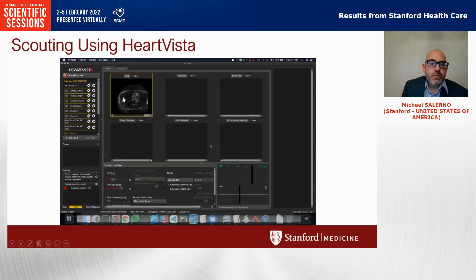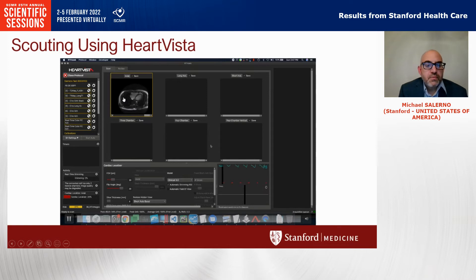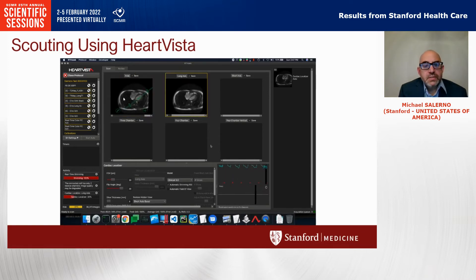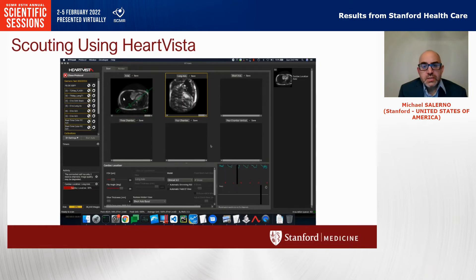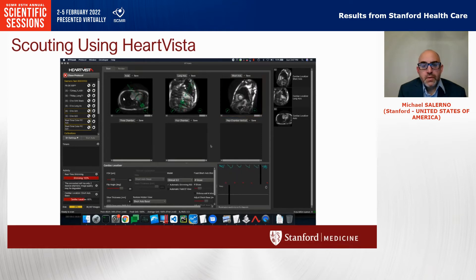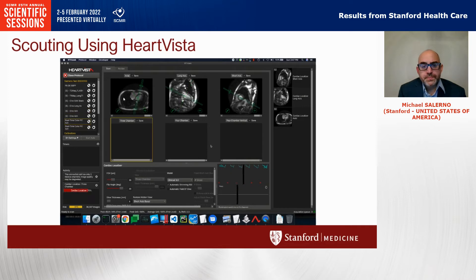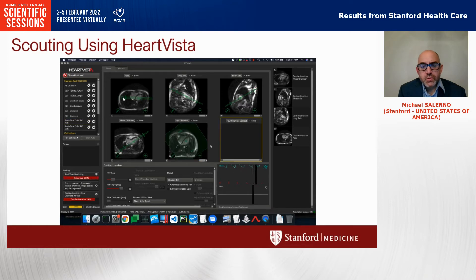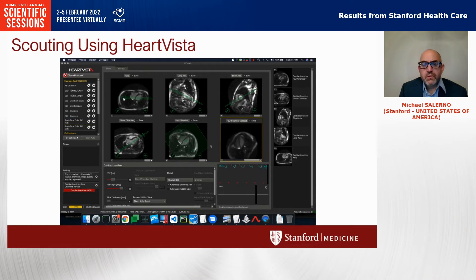We initiated the scouting from the HeartVista framework, and we'll see that it acquires some axial images, then scouts a long axis image followed by short axis images. Then it's going to scout a three-chamber followed by a four-chamber, and finally reorient the four-chamber.